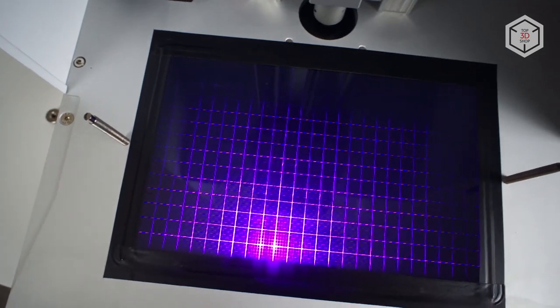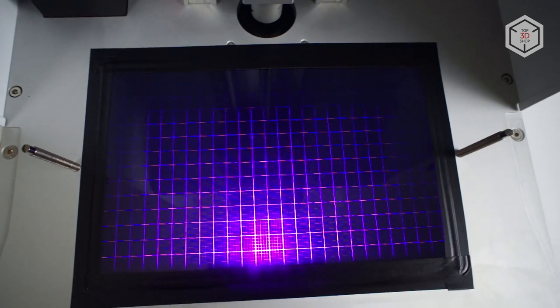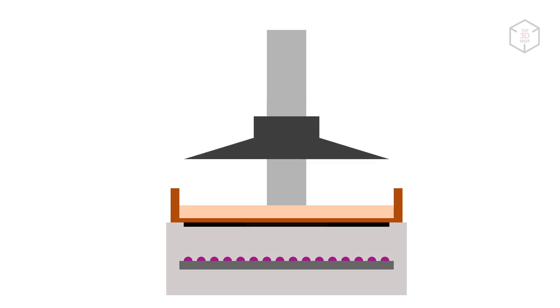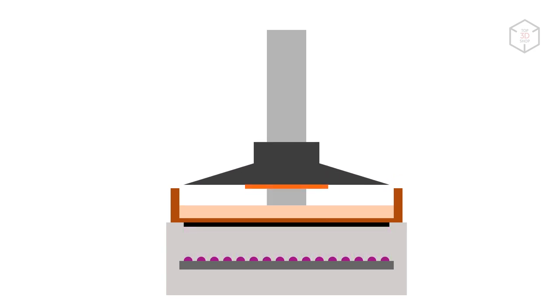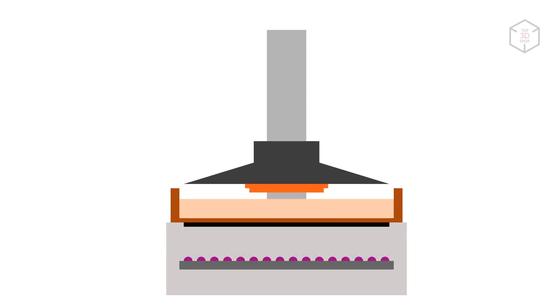The Sonic XL 4K is powered by MSLA technology, or as it is also called, LCD SLA. In short, the essence of the technology is as follows. A photopolymer resin is illuminated by an ultraviolet light source through a screen that displays images of the layers, also called masks. A vat with resin is installed on the screen, with the platform submerging into the resin to the depth of one layer. After the layer is illuminated and cured, the platform rises and lowers down, clearing space for another layer, and the cycle goes on. The object is printed out by layers of cured resin.